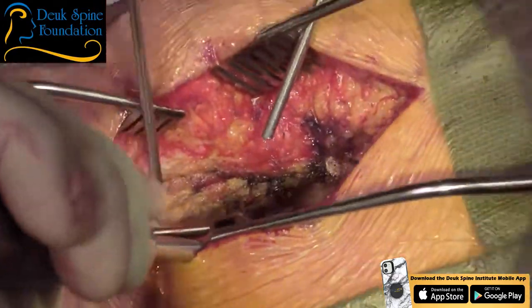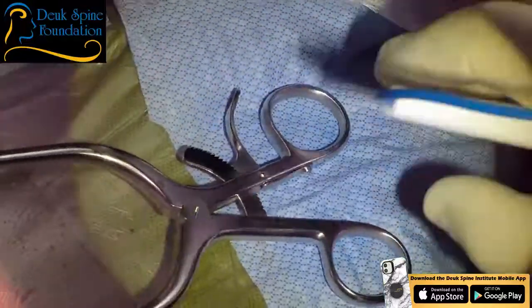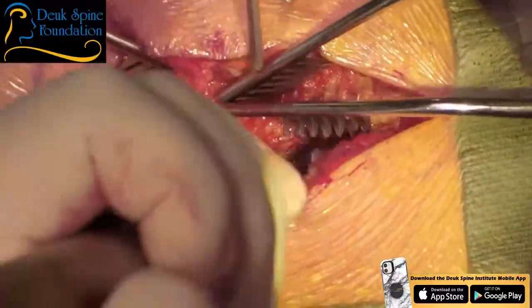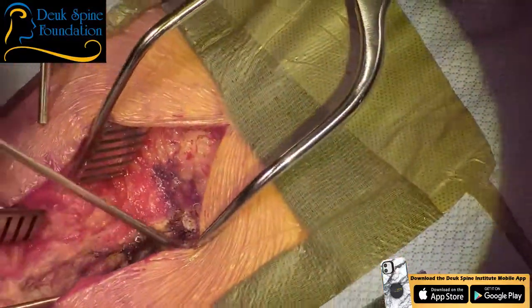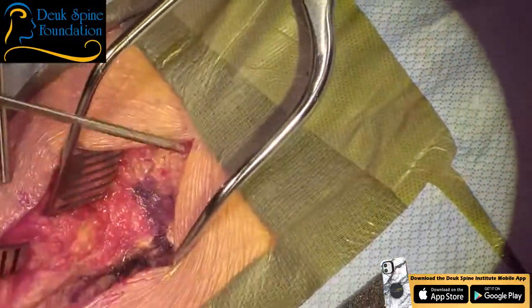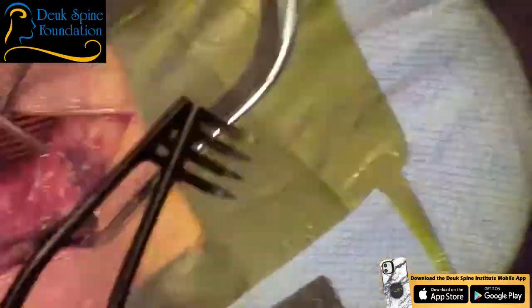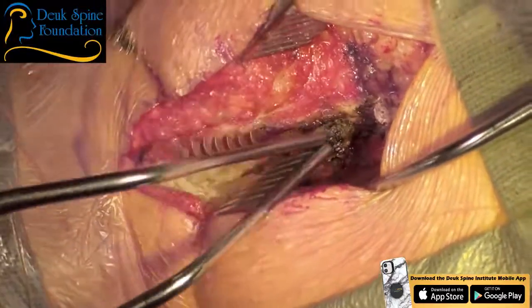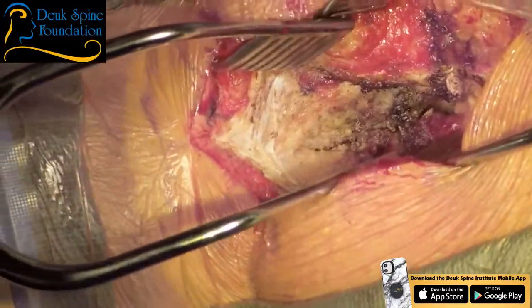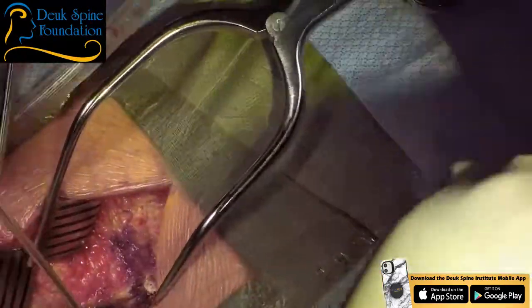And, you know, we want to try to minimize how much we're opening the incision, because the more incision you open, the more trauma to the soft tissues to get the job done. So we want to balance the iatrogenic injury from the surgeon, the trauma, by cutting and dissecting with the need for visibility and safety for the patient, surgery to be done properly. And that's not easy to do. A lot of surgeons struggle with that, Cobb.